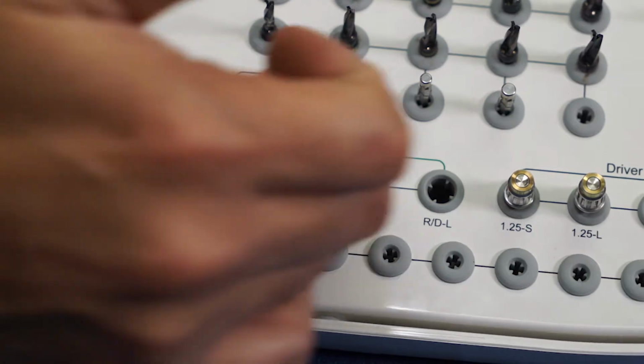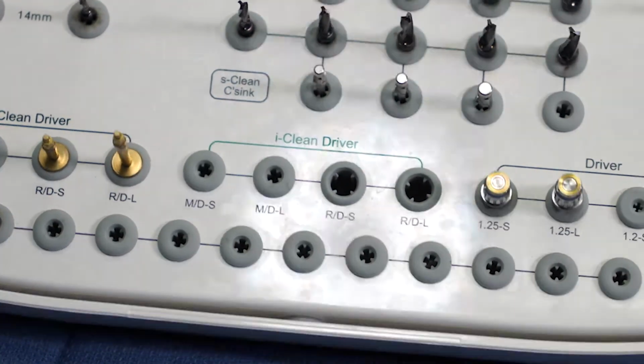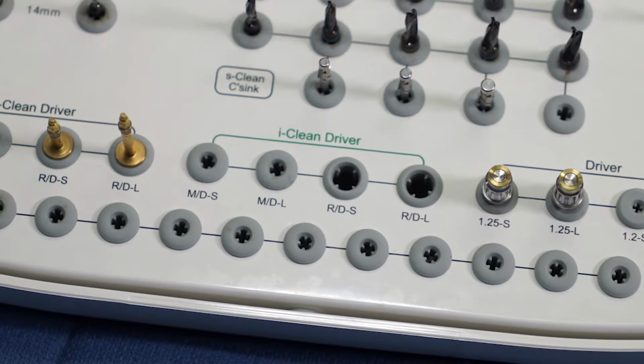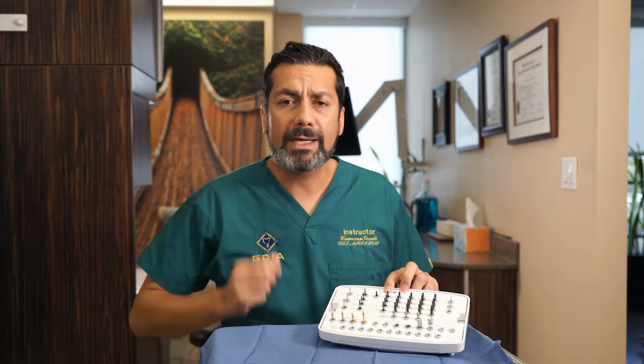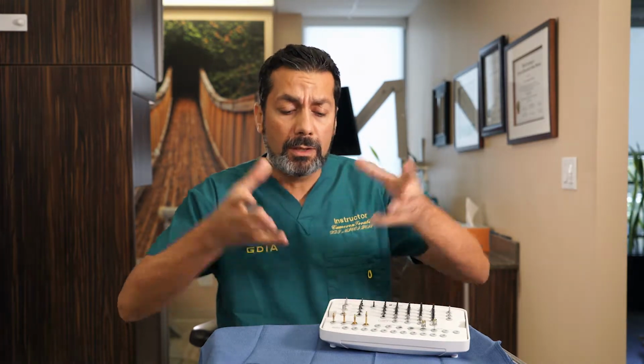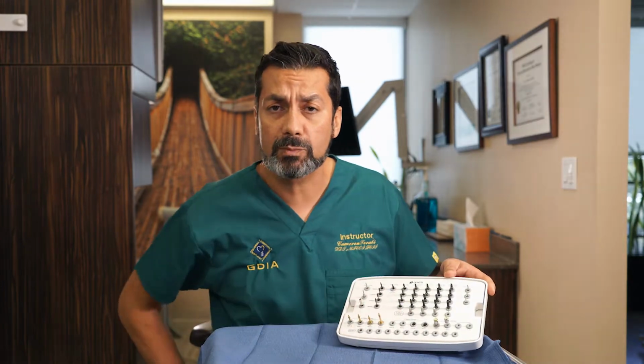These countersink drills at the bottom are seldom used, but they're only used if you have really hard, dense bone, and it's just to open up the coronal portion of your osteotomy for better ease of insertion of your implant. And that is also something that we'll discuss more in detail.